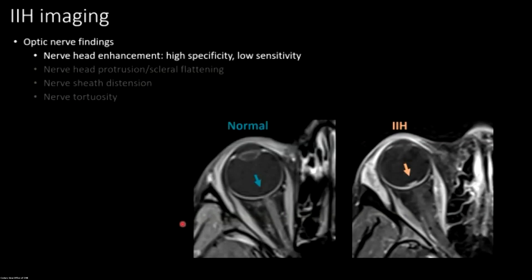Let's go through these findings individually. The optic nerve head should be flat at the back of the globe and shouldn't enhance like a little lump on the back surface of the globe. When we see that protrusion with enhancement, it's pretty specific — almost a papilledema equivalent on imaging.